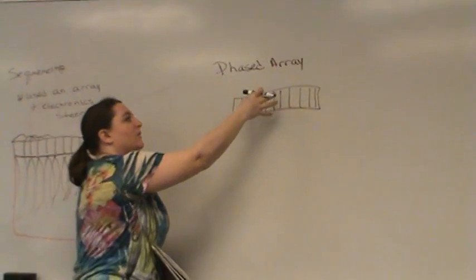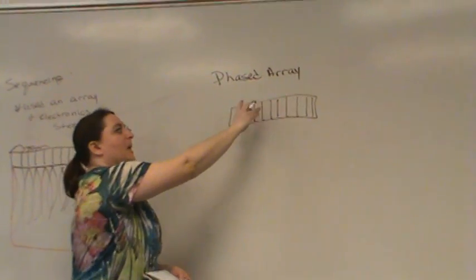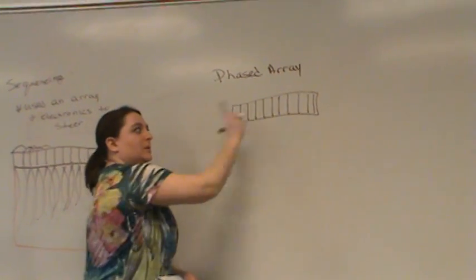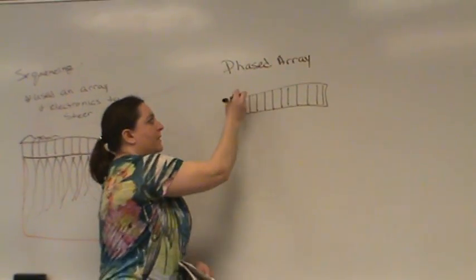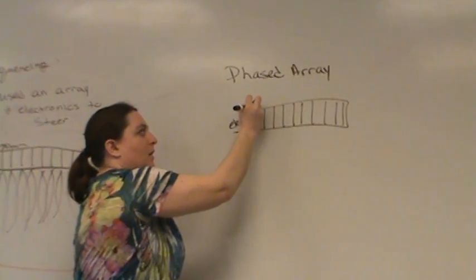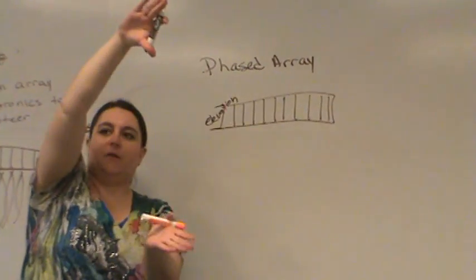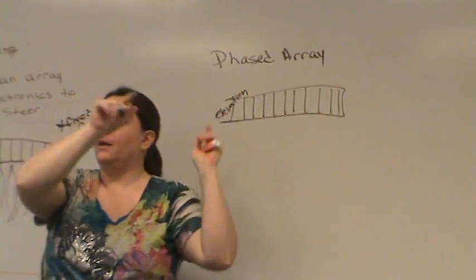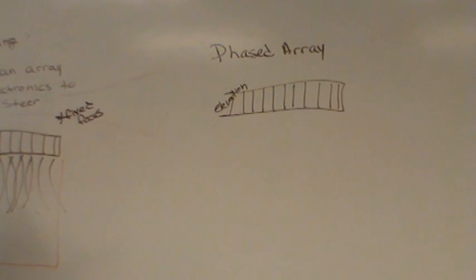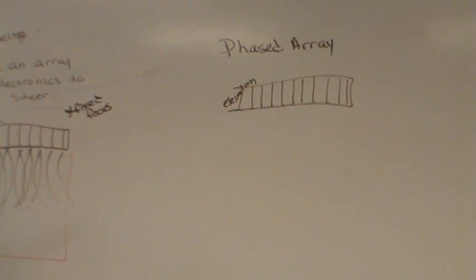If you can imagine, if the transducer was sitting here and we were looking straight at it, the beam that would be coming out, that would be the axial dimension, and the lateral dimension would be this way, and then this dimension here is the elevation dimension. So that beam coming out would have all of those different shapes. It would come out this way for elevation, it would come out this way for lateral, and then axial is just right along the beam itself. Again, I don't draw it very well. Okay.